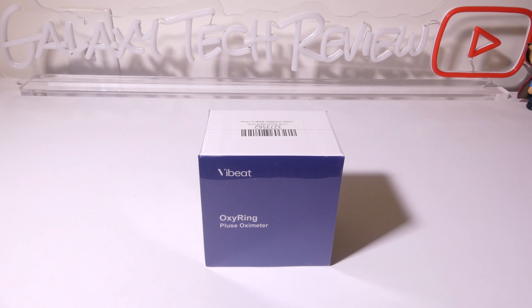So that's my review of the VibeBeat OxyRing Pulse Oximeter. I think this is a good solution for anyone who has a reason to monitor their SpO2 for longer periods of time — say you have COPD or sleep apnea and you want to track these metrics while you're sleeping. Overall, I was impressed with the app and how it integrates with this device, being able to track everything and then export it and save those files for your records or for your healthcare provider.